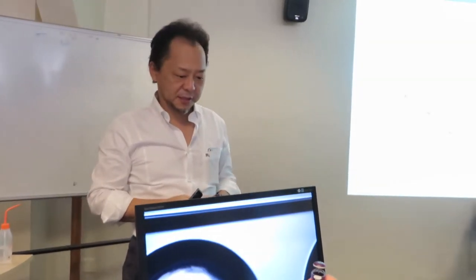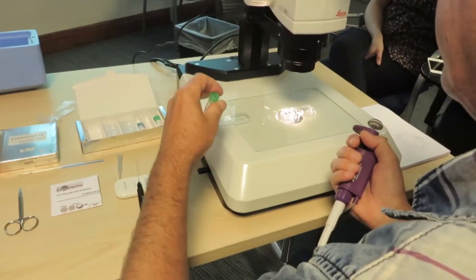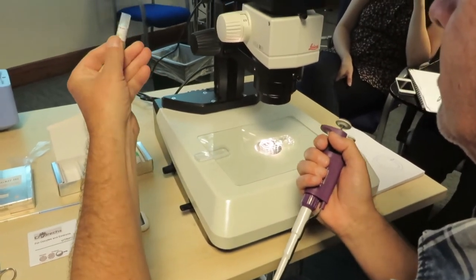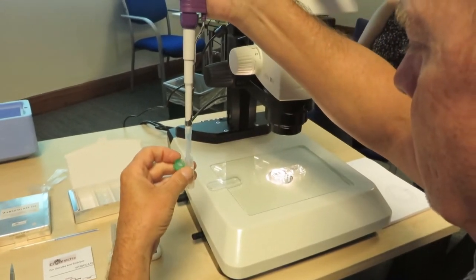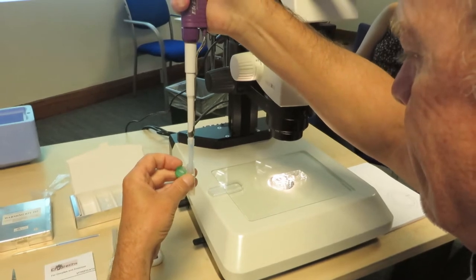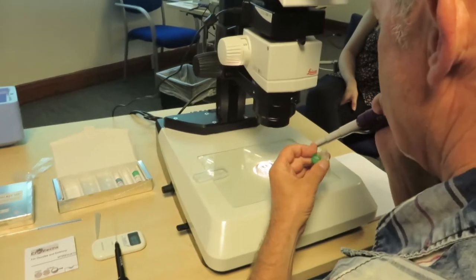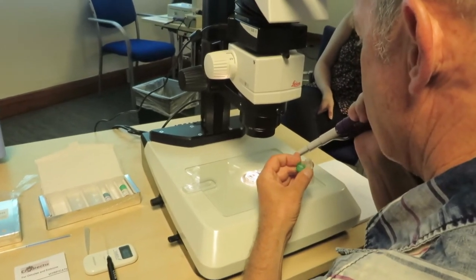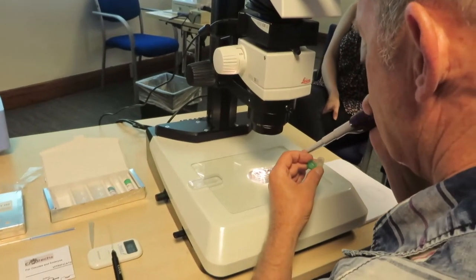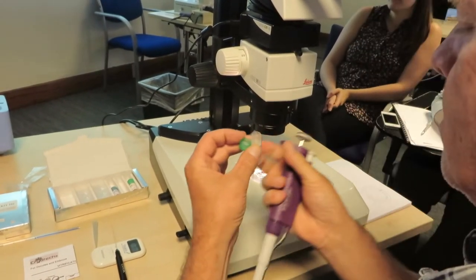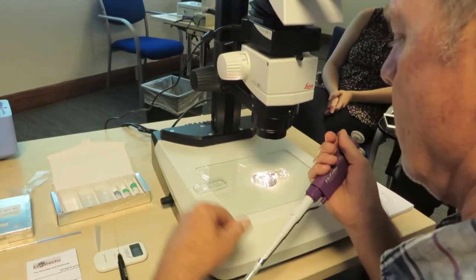First, I touch, then touch the temperature. If it's not cold, then upside down and open the lid and pour 300 microliters. Please make it slowly. First aspirate and expel to make a bubble in the solution, then aspirate and then pour. Again, the VS, touch, upside down, open the lid, aspirate and pour. Three hundred microliters. This is the preparation. Now the plate is ready.